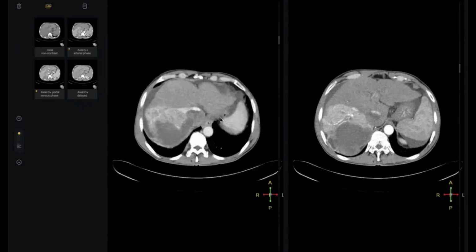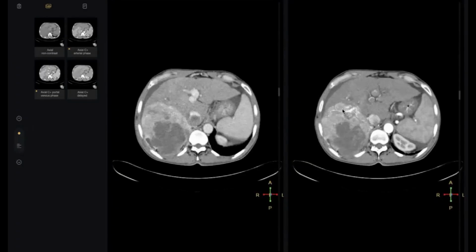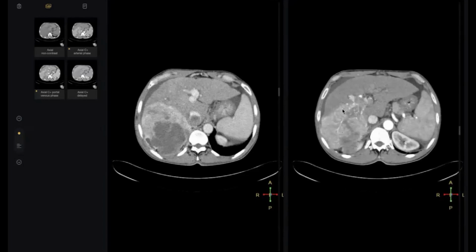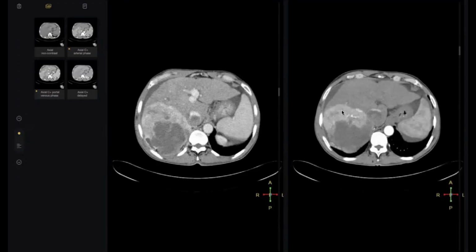By the way, my colleague started with whether the liver is cirrhotic or not, at least radiologically. Most of you didn't mention it. This is very important. Why? Because LI-RADS is applied to cirrhotic patients. Okay, my colleagues? Okay, thank you.